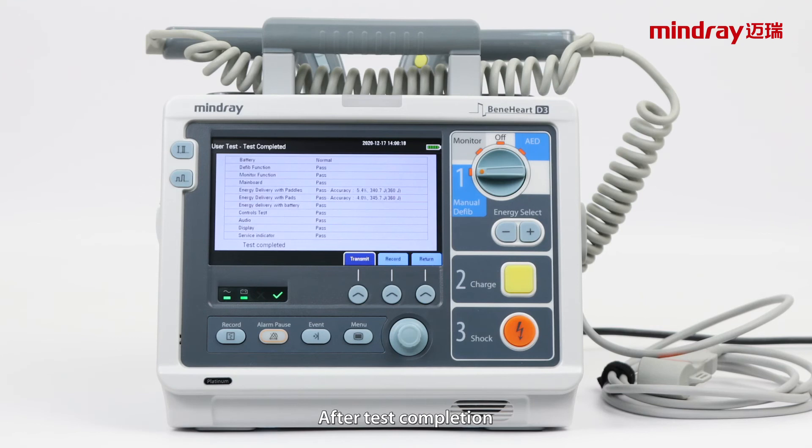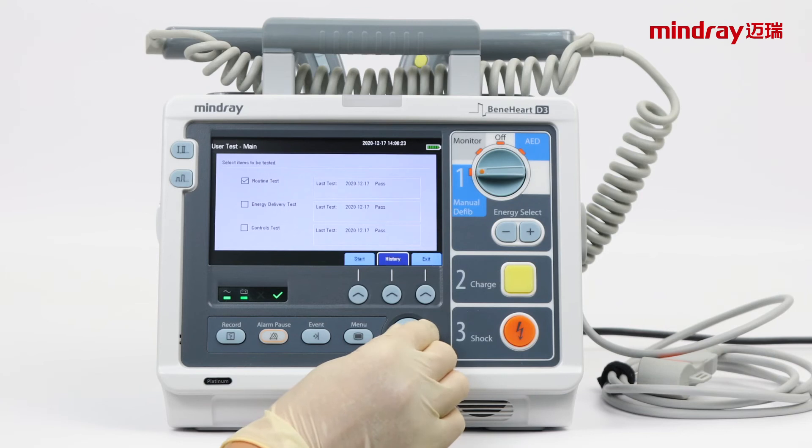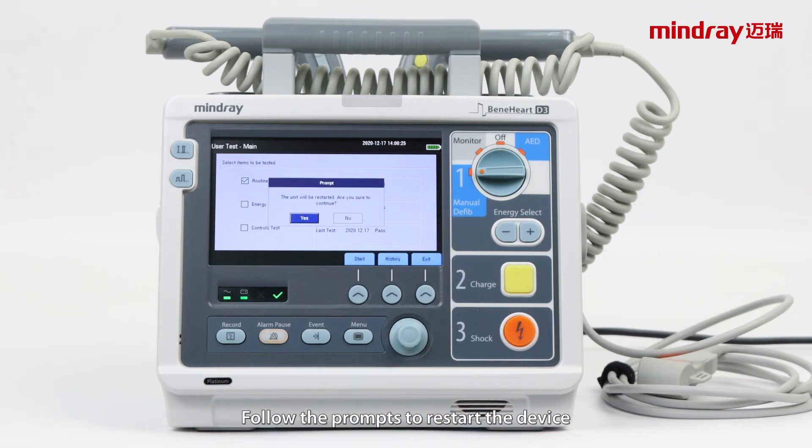After test completion, make sure all tests passed and press return. If there is any test failure, you can check the failure item in history. Follow the prompts to restart the device.